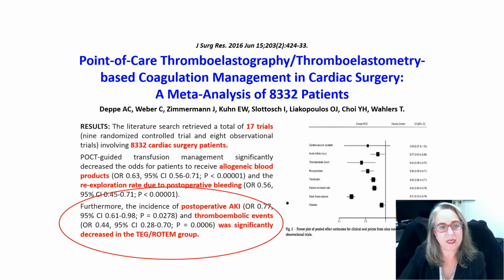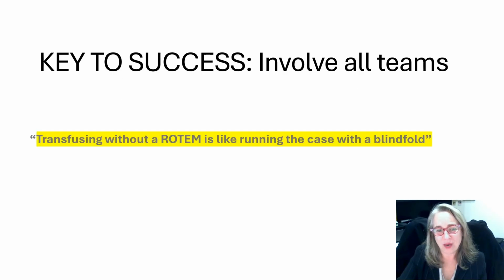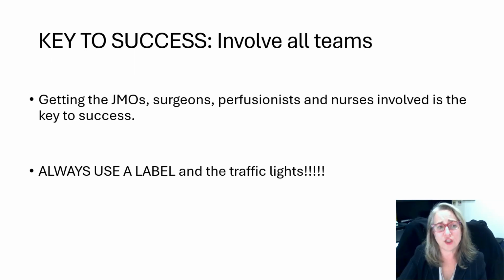Just another example about how using point of care testing in these patients for cardiac surgery can reduce acute kidney injury, thromboembolic events, and it's a good thing to do. But the best science in the world means nothing if you can't get the humans to engage. And I remember one of the obstetric anaesthetists from the UK saying to me that transfusing without a Rotem was like running a case with a blindfold. Someone that came from the UK, where this is really very widely used.